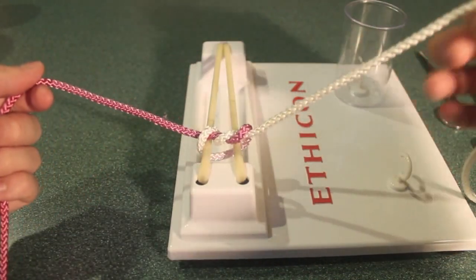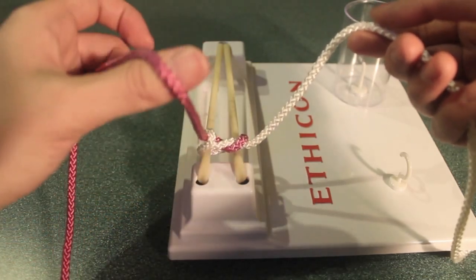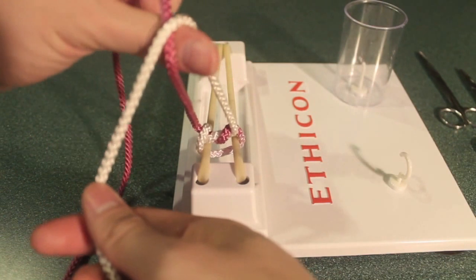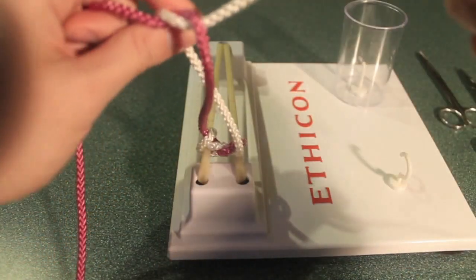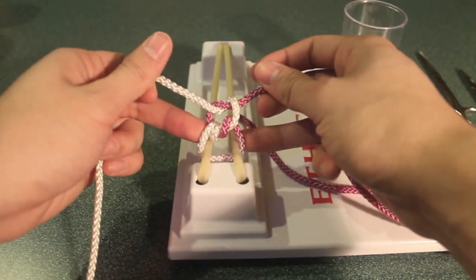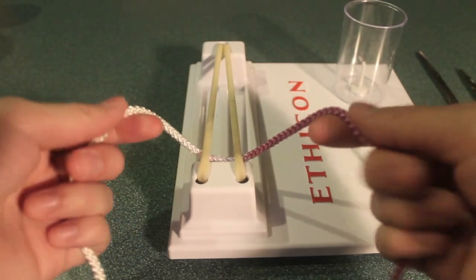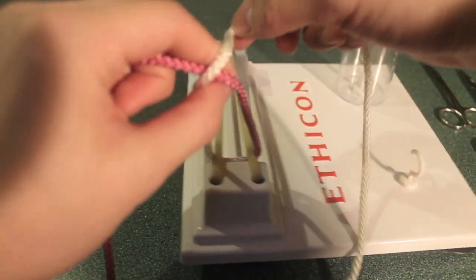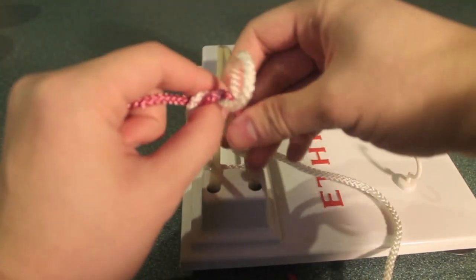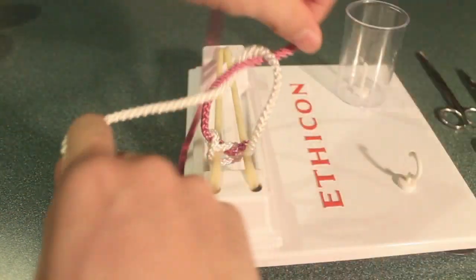That's the first step. Then we move on to the second step of the knot, which is identical to that of tying a square knot. Create the loop over our thumb. Pass our index finger and thumb through the loop towards ourself, grasp the free end of the suture, and pass that out away from yourself through the loop. Then we pull horizontal, crossing our hands to make sure that the knot is flat. And there we have our surgeon's knot. Let's do the surgeon's knot in real time — two twists on the bottom and one twist on top, crossing our hands to make sure the knot is flat.